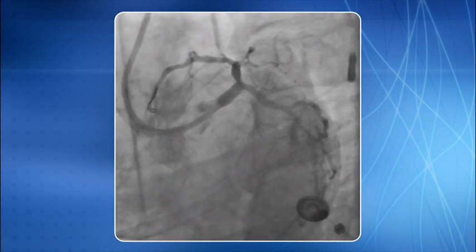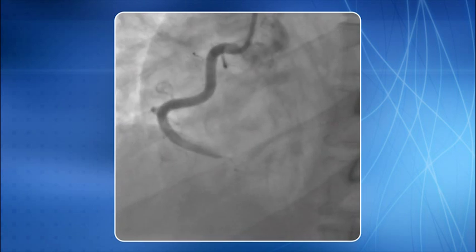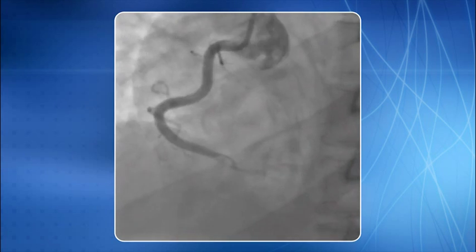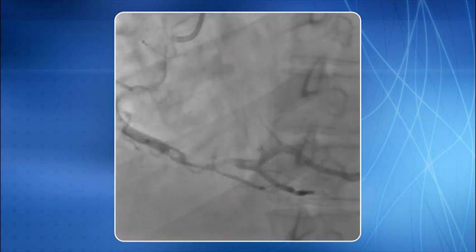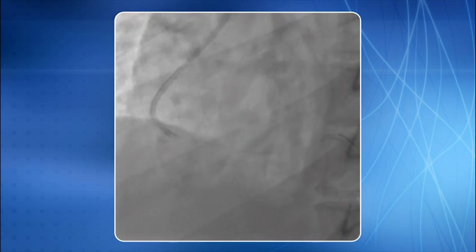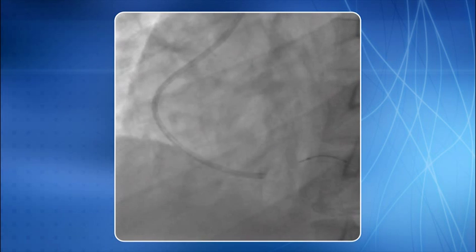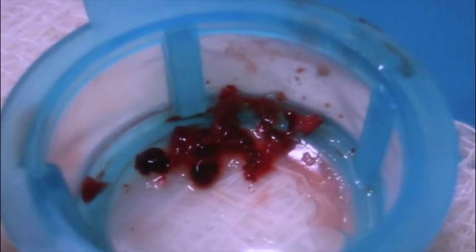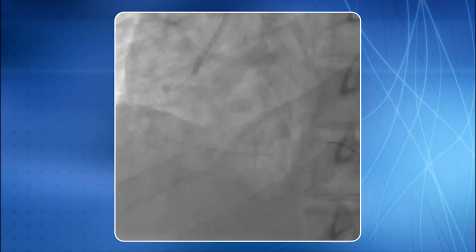This is an example of acute inferior wall MI and cardiogenic shock, showing a huge thrombus burden in a large RCA. Deep intubation of a 6F JR4 guide catheter was performed, with the distal tip of the catheter placed at the site of the thrombus. Thrombosuction was performed through the guide catheter itself, and a large amount of thrombus was removed. RCA injection after thrombosuction reveals good flow.